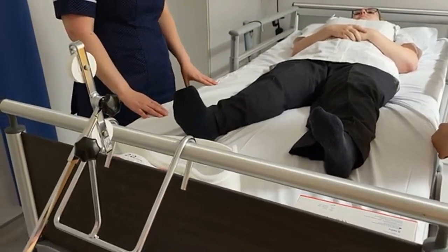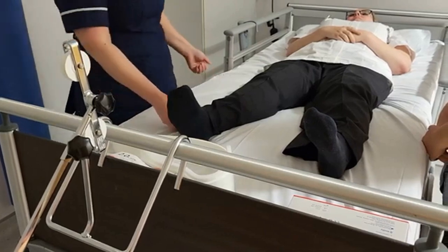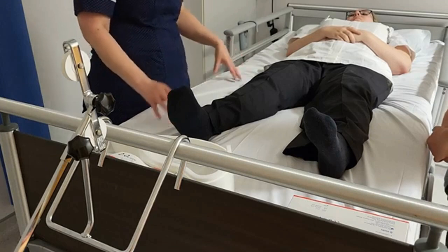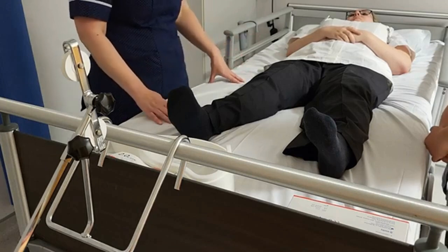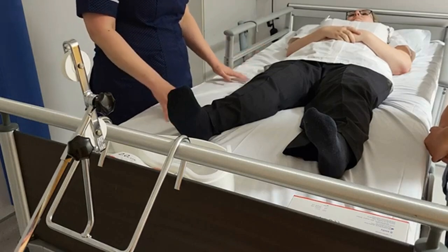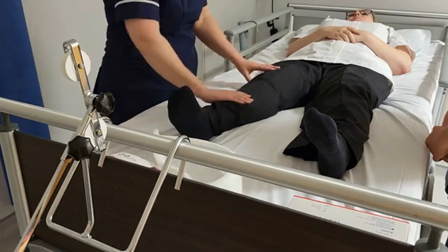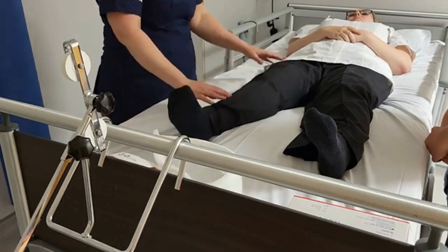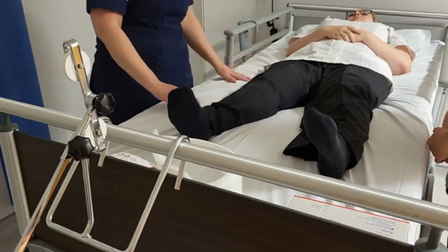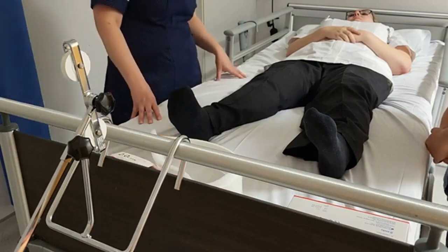Applying straight leg traction for a fractured femur. For the purpose of the video our patient is wearing her trousers, but in reality the patient would have their trousers removed so that you can inspect the skin and ensure the traction goes directly on the skin. Once we've inspected the skin and looked for any cuts, abrasions, or sore areas, and made sure it's clean and dry and any wounds have been dressed, we will need three members of the team to put on this traction.